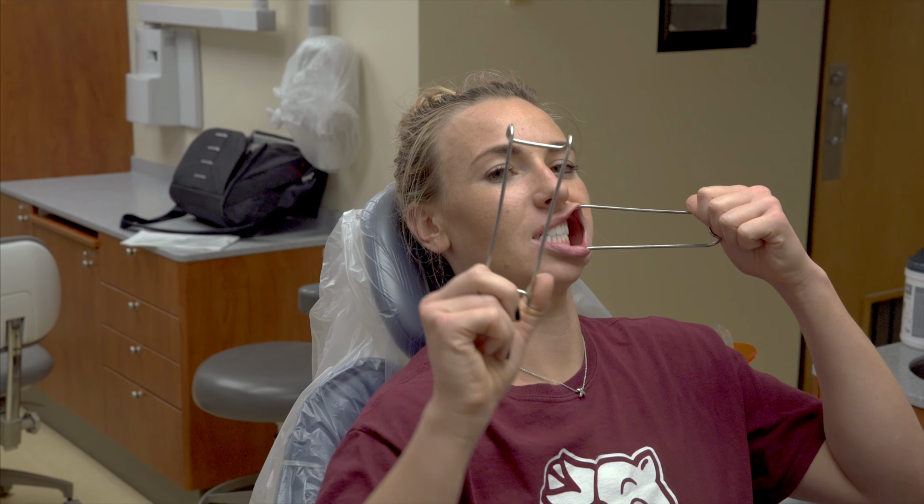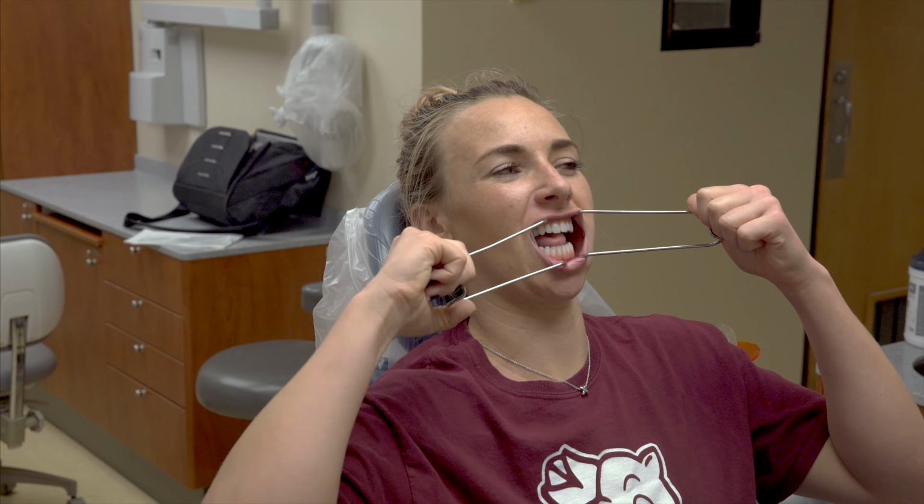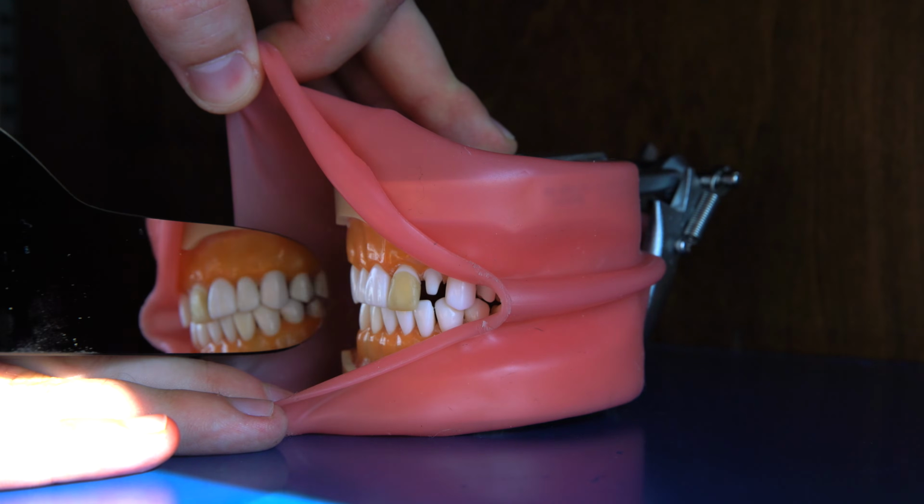Next, we will move on to the buccal shots. For this image, we will use the metal cheek retractors and the 1B mirror. Use the large end of the metal cheek retractor as the mirror slips into the space appropriately. Often, you'll have to have your assistant place the retractors for the patient, retracting more on the side of the photograph and relaxing the contralateral side.